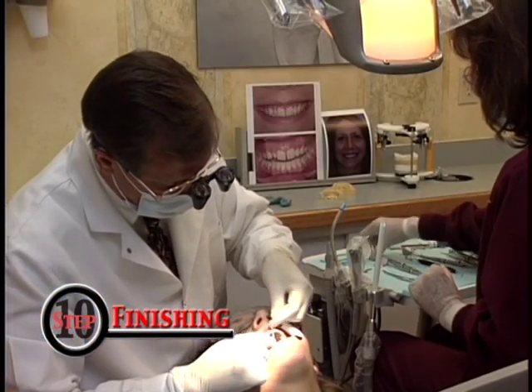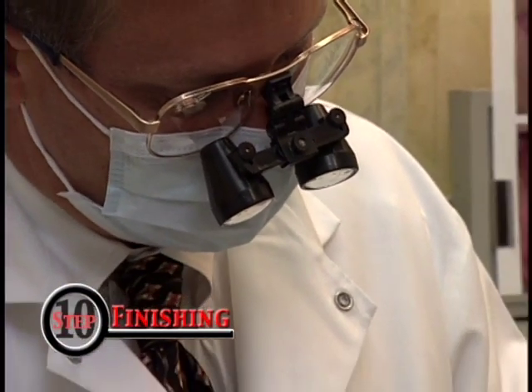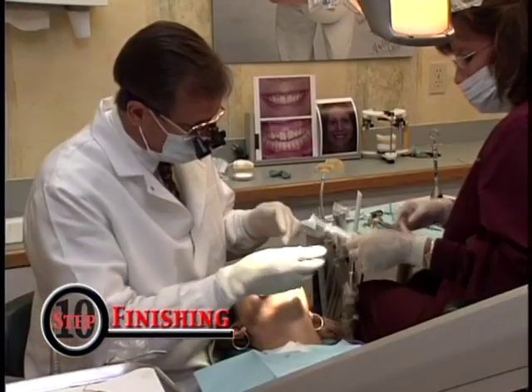Finally, we need to add the incisal halo. Since we will be continuing this procedure on the number 9, number 7, and number 10 teeth, we'll apply the incisal halo upon completion of the other teeth.